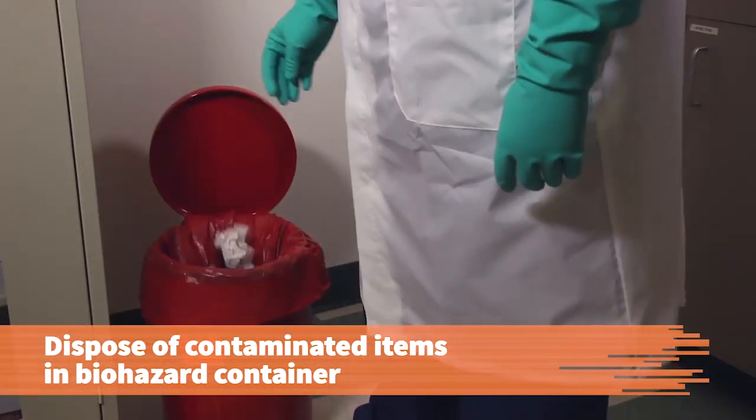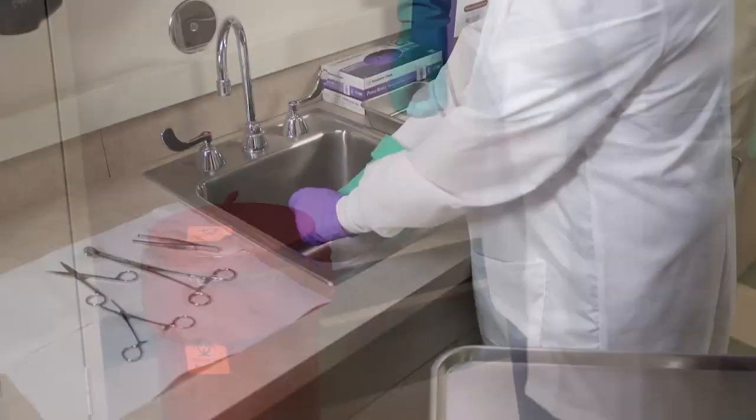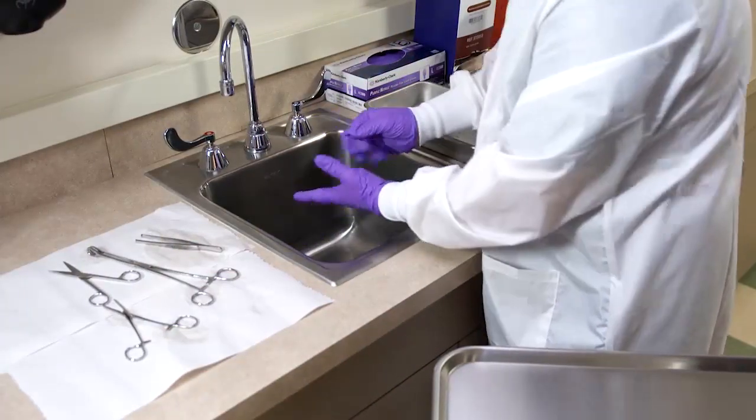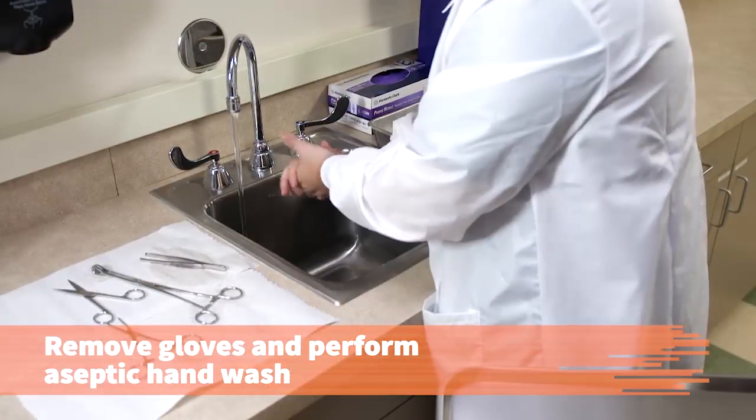Dispose of contaminated towels and the disposable brush in a biohazard waste container. To remove any possible contaminants, take off the gloves and perform a medical aseptic hand wash.